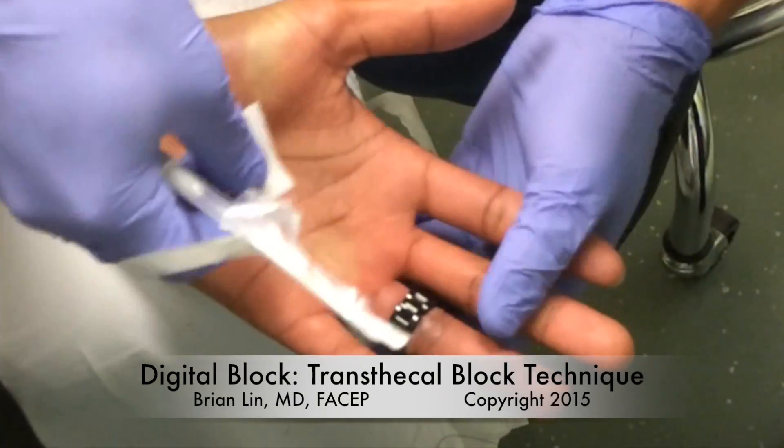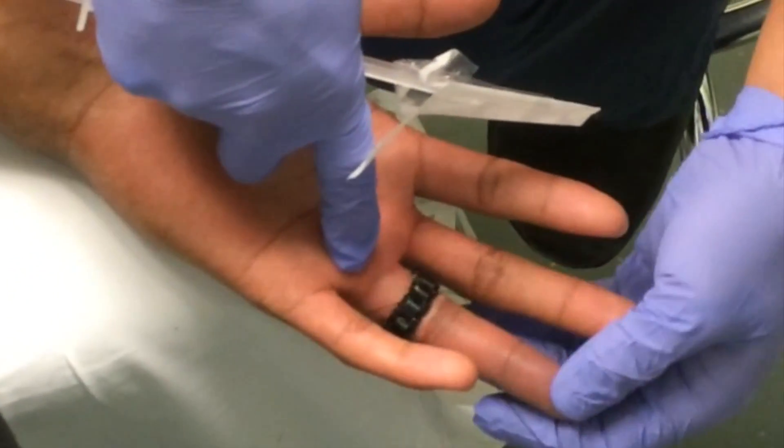This video describes the transthecal digital block technique, an alternative to the conventional digital blockade technique.